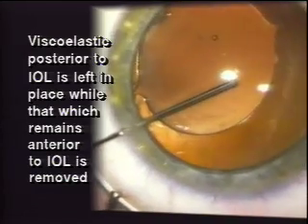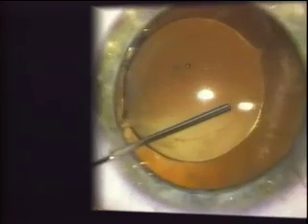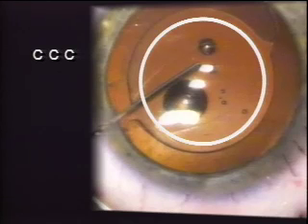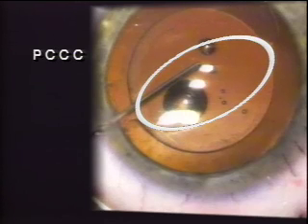In this case, the PCCC is slightly smaller than ideal, making it more difficult to vault the optic through the opening. Once capture of the optic is achieved, instantaneous stabilization and fixed centration of the IOL optic will occur. The anterior capsulorhexis opening will remain circular in configuration while the posterior capsulorhexis opening takes on an oval shape due to the haptics remaining in the bag.